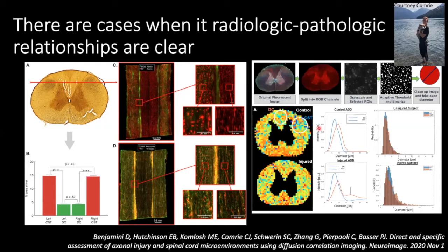What we found was that you can get these types of axon diameter distributions by doing some fairly simple things in MATLAB. And this is very relevant for what we're actually measuring using a very sophisticated imaging approach. So to me, that's a clear-cut case of where quantitative histology can really contribute to validation.